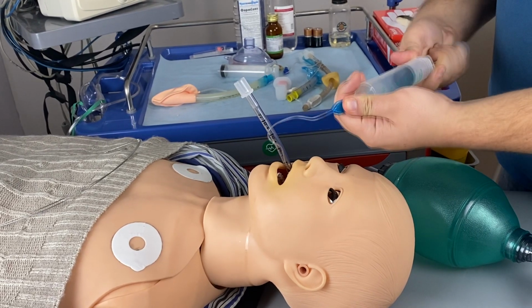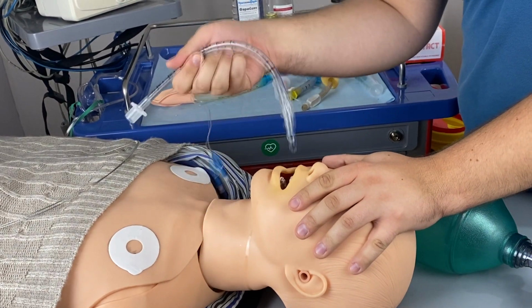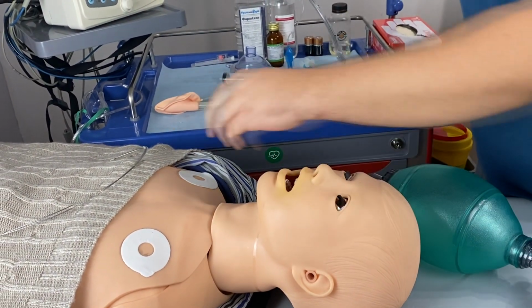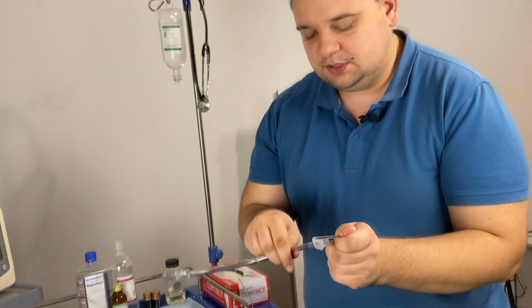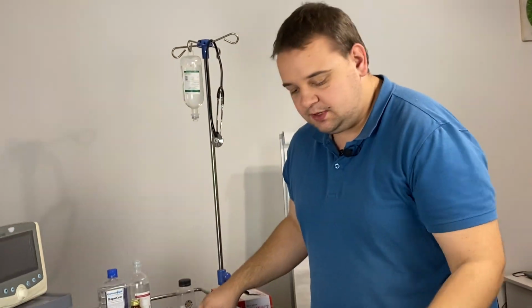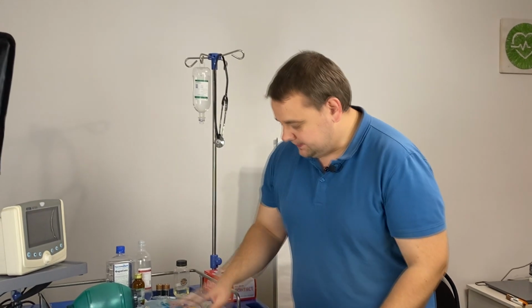And also to remove the tube, we deflate the cuff, then we just extract the tube. You can do that without the introducer or with the introducer. This is actually dependent on the anatomy of the patient, on the nature of the situation, on your habits. So this is also up to the professional responsible for intubation.